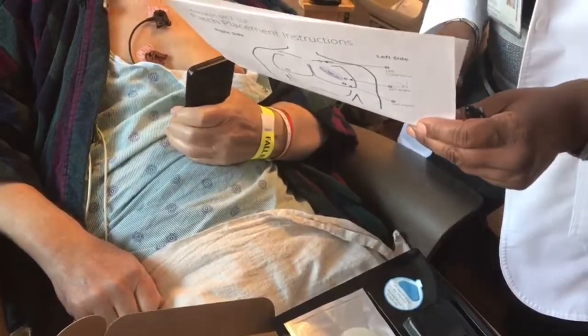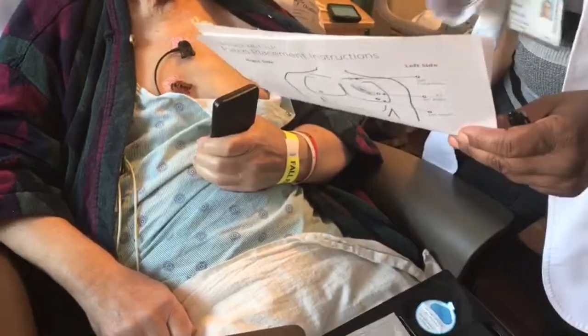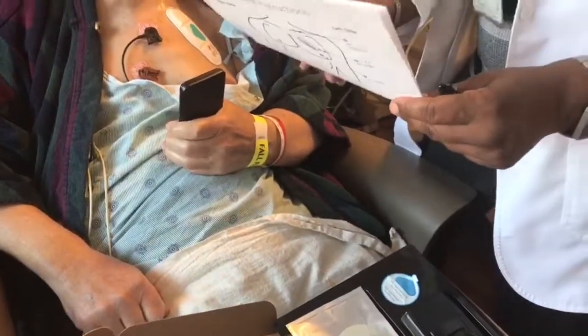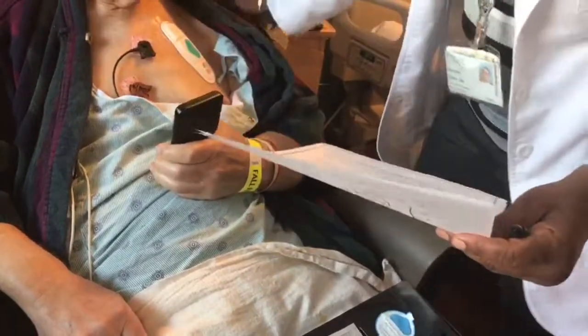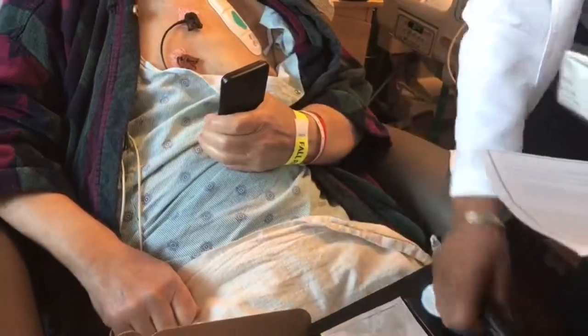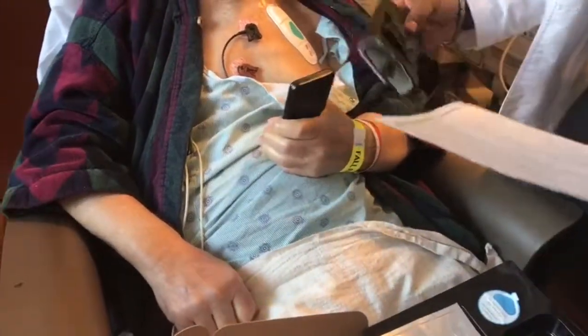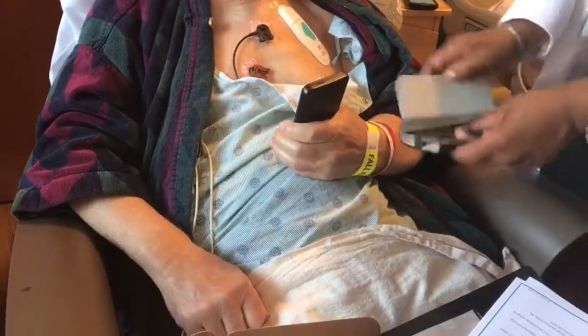The sheet said to call when you get home, but I already called because you have a quieter drive and I didn't want anything to happen on the way. Pretty much just keep it in his pocket like he would his cell phone. You have a case — you can clip it on your belt, loop it through your belt, or just stick it in your pocket.